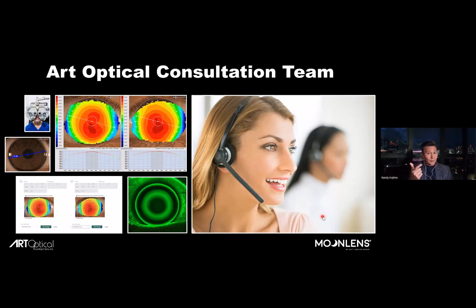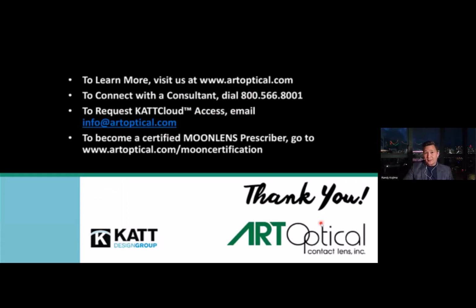They understand orthokeratology, and if that's new to you, they can help you with the procedures and practice that way. So they're an absolutely critical component to successful ortho-K, and I just can't understate how valuable Bethany and the art consultation team is to us in all of the designs we use, whether it's ortho-K or corneal GP or scleral or whatever it might be, custom soft.